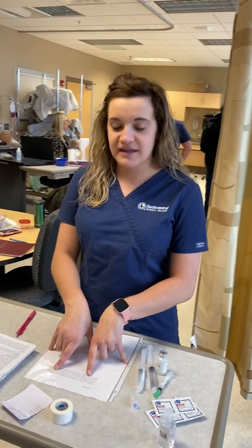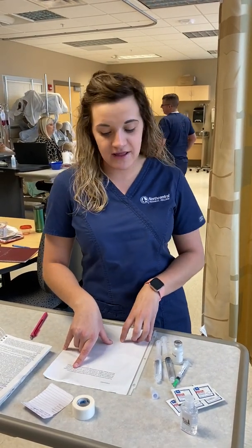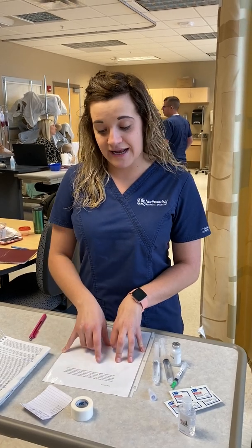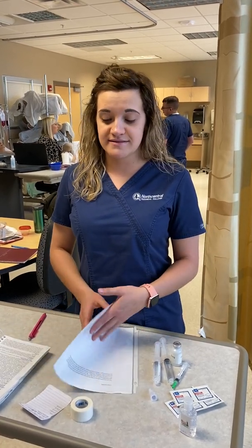He has a PICC line in place for his chemotherapy due to his lung cancer. So that's why we're going to give the med the central line way. And he is reporting a chest pain of 8 out of 10 that is currently getting worse.